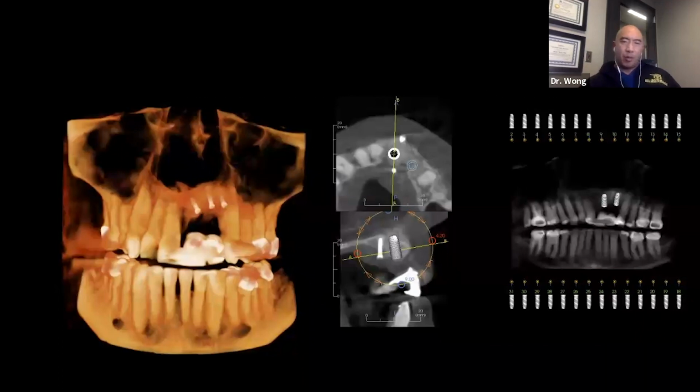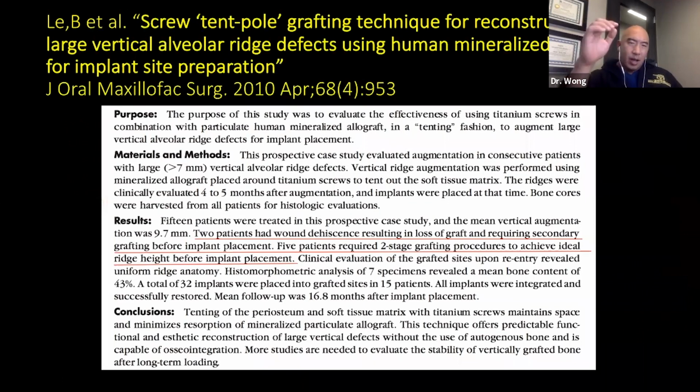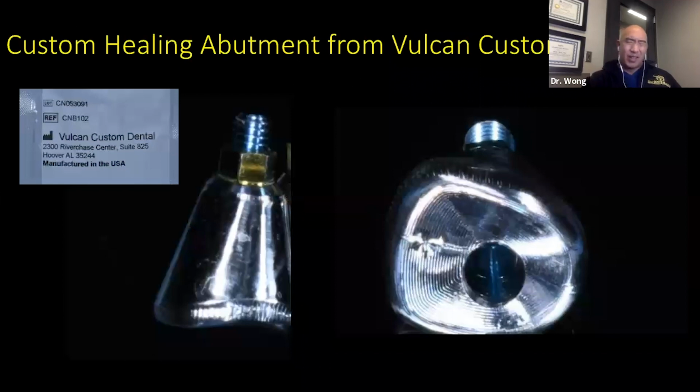You can see from our CBCT, got a whole lot of width, bone growth almost to the head of the screws, which is great. After looking at some of Bach's research, I felt a lot better about myself, because even in the research, it looks like a good percentage of people, when they have defects that big, do have to go through multiple surgeries a lot of times. So I didn't feel too bad.